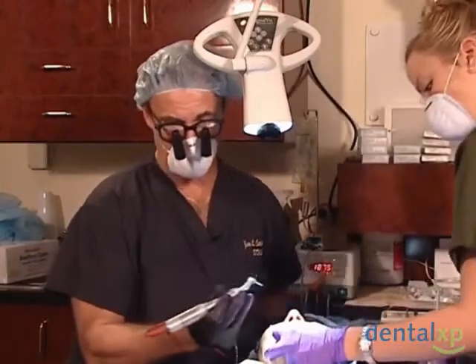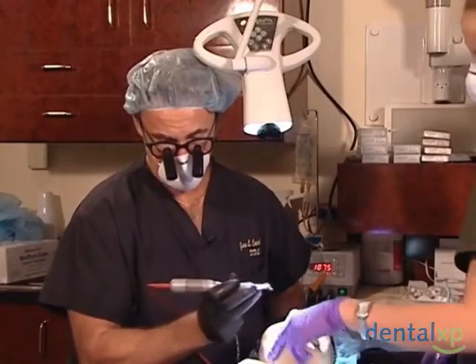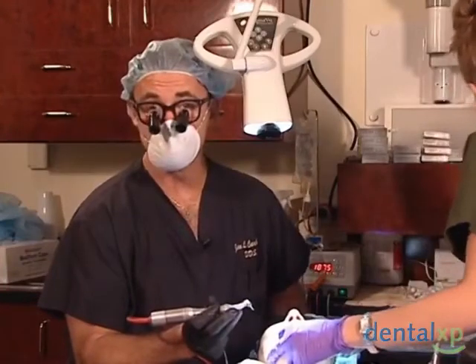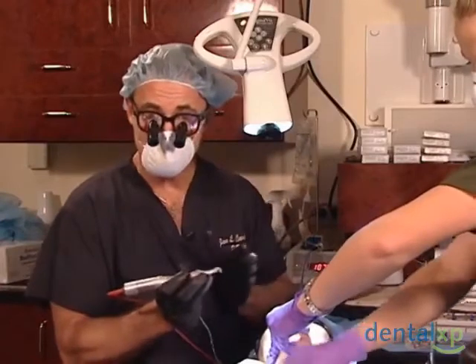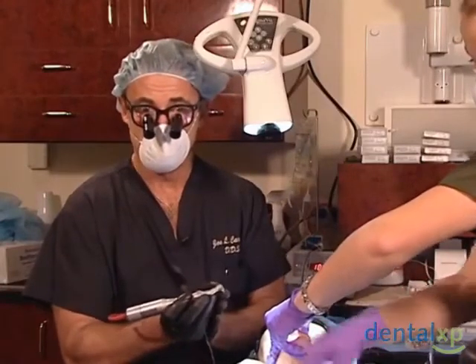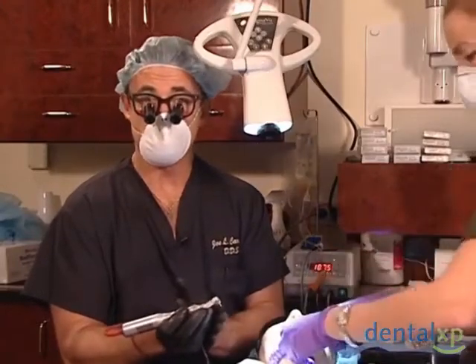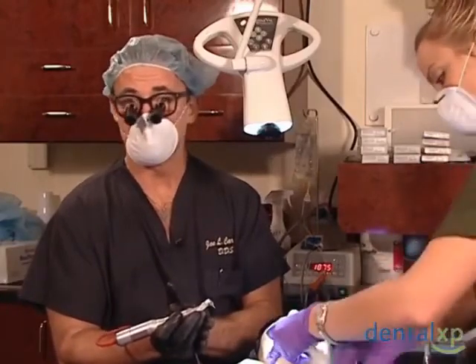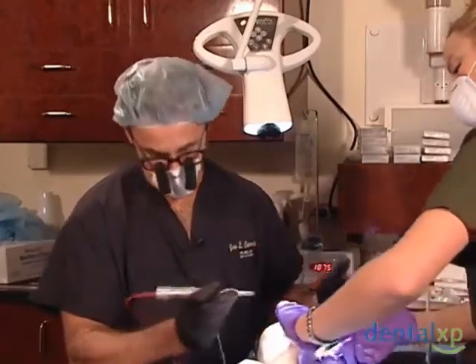We're going to go on our most distal implant after I go to the depth and make sure we're at 15 millimeters. I'm going to go to the most distal implant and try to place the implant. If I can get it within 2 millimeters with finger pressure, then I can go ahead and use my wrench. If I can't, that means that implant is not able to tap the remaining portion of the bone, or osteotomy. So what we have to do is go back and enlarge the osteotomy, or another way of looking at it is make the bone less dense in that area so that we can get our implant seated with 35 newton centimeters of pressure or less, but keeping in mind we want it stable.